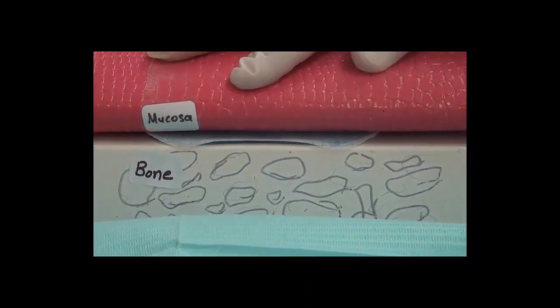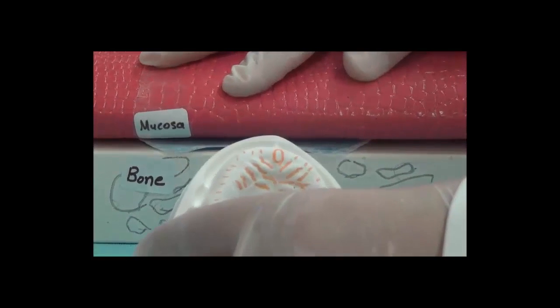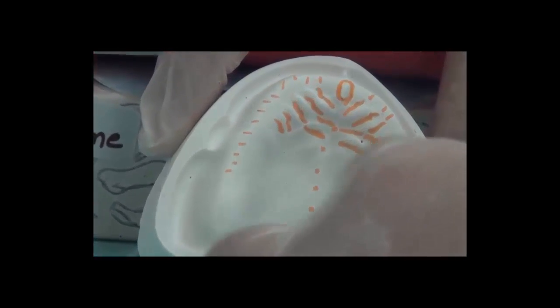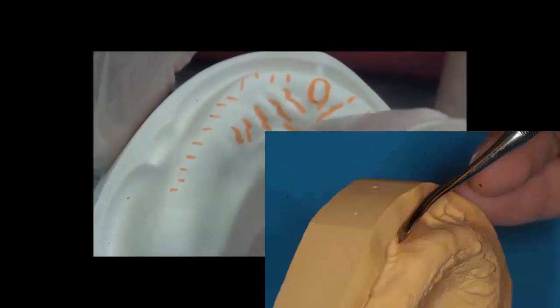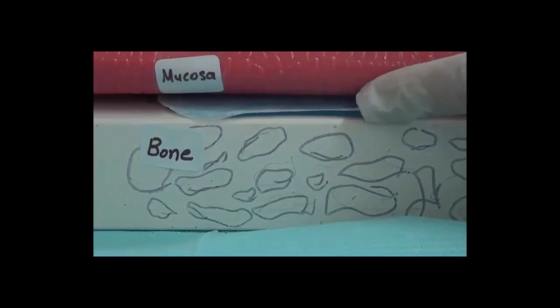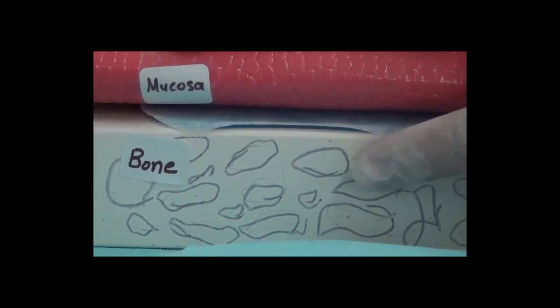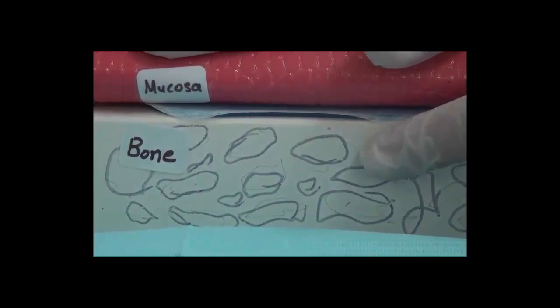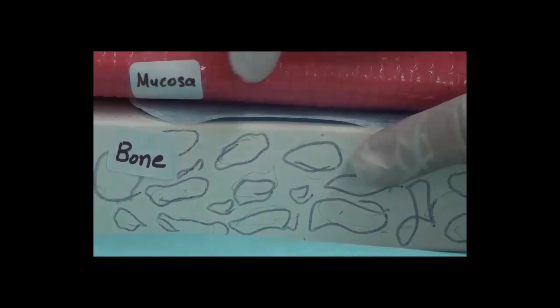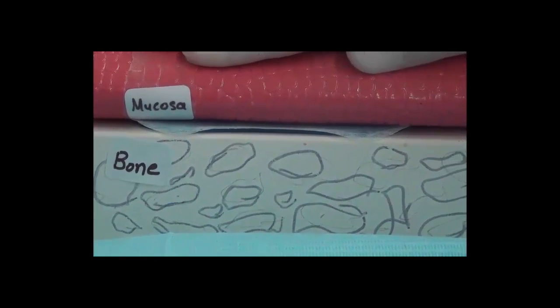Now we're going to review reasons why we need to relieve these areas using wax. The first reason is present in the following areas: around the tuberosities if they are bulbous, around undercut areas, and in the mid-palatine raphe area. This reason is that underneath the mucosa, the submucosal layer is not as thick as in the other areas we have shown earlier. It is a thin layer, and underneath it is hard bone. So if we compress this mucosa, and it's trapped between the denture material and the bone, this mucosa can be easily traumatized because it's thin and the layer of the submucosa beneath it is thin. So these areas, if under pressure, can be easily traumatized under the denture.